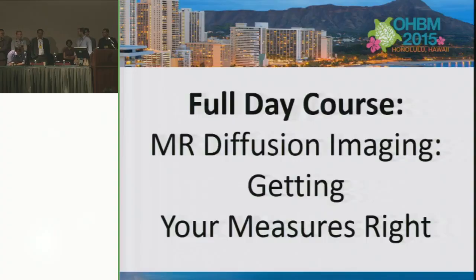So I think the question essentially is, how can we interpret FA value not in white matter? What is the meaning of FA value not in white matter? I think there is structural organization also in gray matter. If we go to high resolution, high field, we also see clearly anisotropy in the cortex, and probably inside the gray matter nuclei we might see some structural organization.